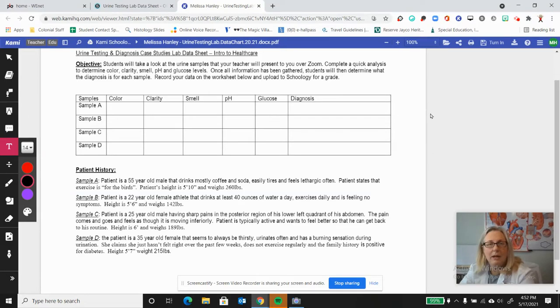While we make sure you have the color, clarity, smell, pH, and glucose, if you want to discuss it or write down what you think the diagnosis is, take this moment to do that. We can pause this video, or we're going to keep moving. I'm going to keep moving. Okay, welcome back. If you paused, here we are.